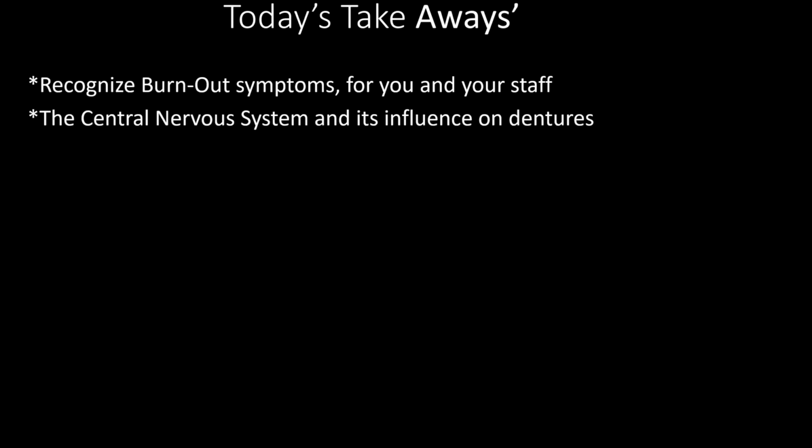So what are our takeaways? Well, number one, recognize burnout for you and your staff and the repetitive problems. What was causing those repetitive problems was that we were using denture teeth that were locked together and we weren't setting it within the architecture of the mouth. The central nervous system is built on patterns, and then how that influences the denture.